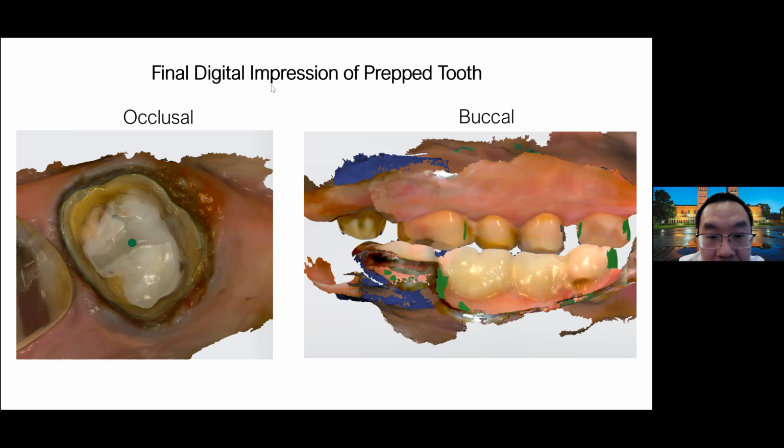So can you do the crown prep before and book the appointment with you for the scanning? Yes, you can. We prefer that you do the prep in our section because we have better control of where you leave the margins. We have better quality control in that sense. And just in case, we know right away this is not a scanning case, everything is subgingival already. Then we can plan for the PVS impression instead.